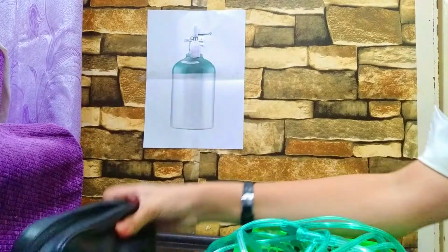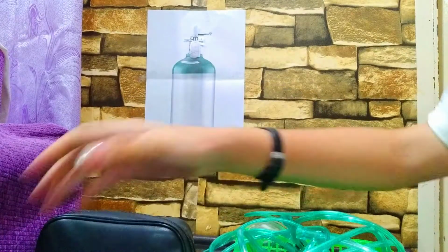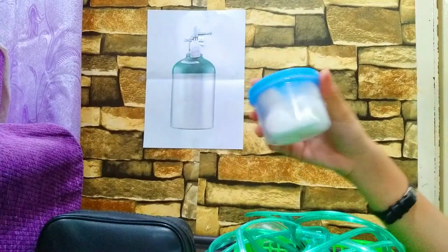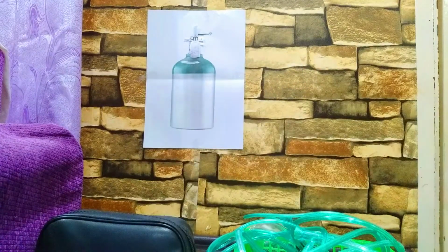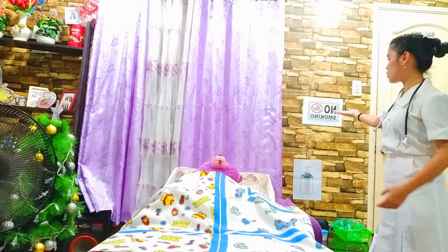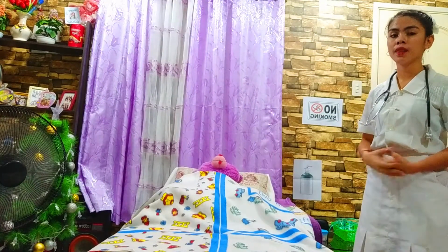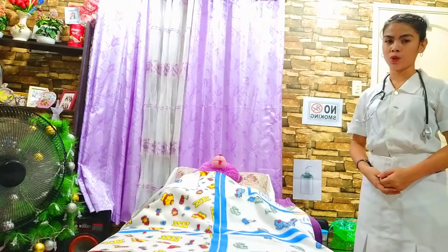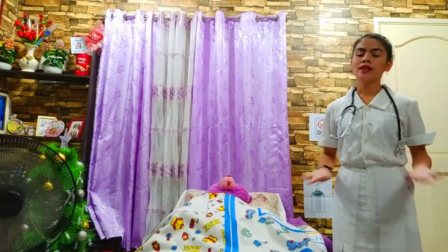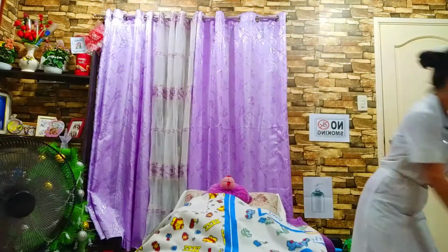Also, we have here the tools for getting the vital signs and the moist cotton balls for cleaning the nostrils. And as you can see, we have here the no smoking signage for the safety of the client during the implementation of the procedure.